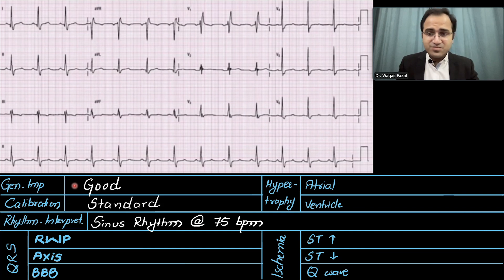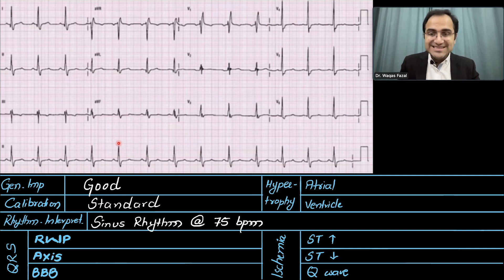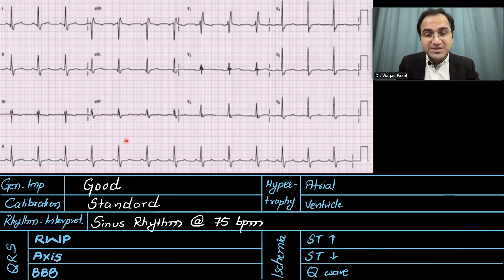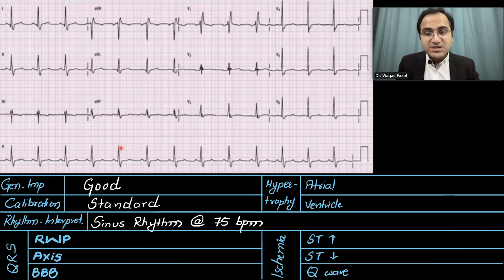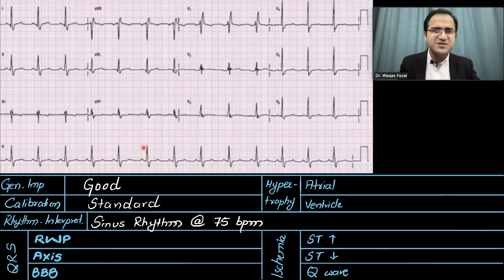Now let's look at the rhythm. P waves are present and married to the QRS complexes — P waves are followed by QRS complexes — so it is a sinus rhythm. Now let's calculate the rate. We calculate the number of large boxes between two RR intervals. Between these RR intervals we have four large boxes: one large box equals 300, two equals 150, three equals 100, four is approximately 75 beats per minute. So the rate is approximately 75 to 80 beats per minute.